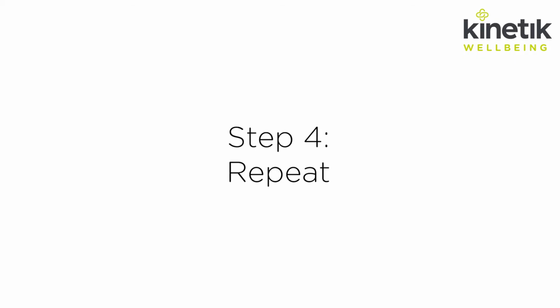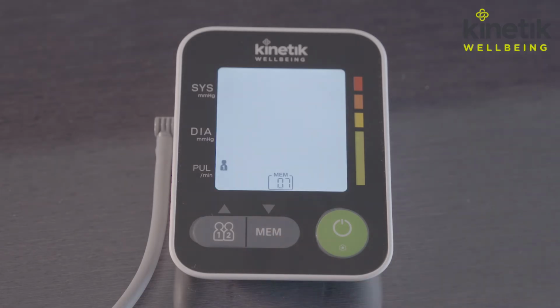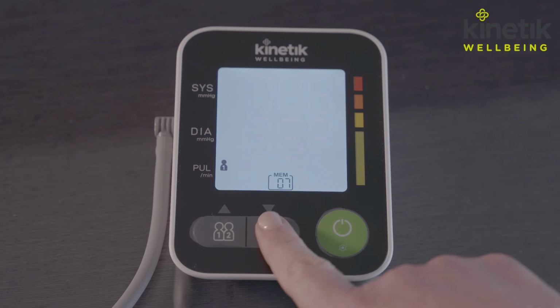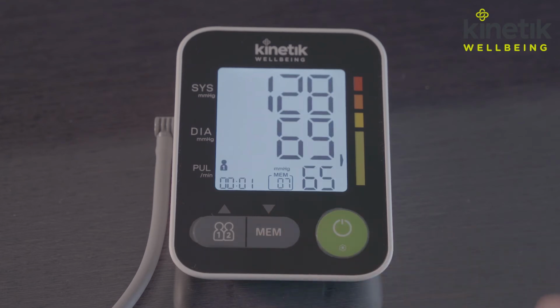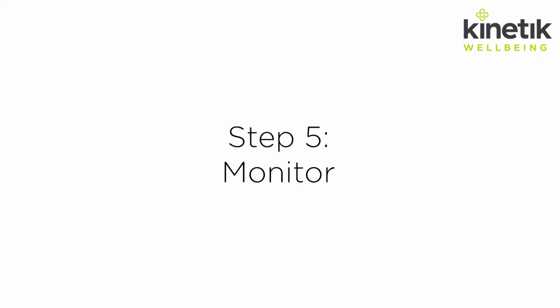Step 4. Repeat. It's recommended that you take 2 or 3 additional readings each about 2 minutes apart to find your average. Step 5. Monitor. It's a good idea to check your blood pressure regularly. If you're concerned about your reading, speak to a healthcare professional.